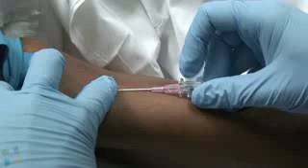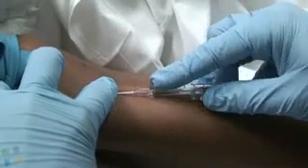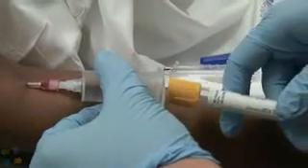While holding the needle still, slide the catheter over the needle and into the vein. Remove the needle and occlude the tip of the catheter to prevent extravasation of blood. Remove your tourniquet. If needed, attach the blood transfer device and draw blood by placing the vacuum tubes onto the covered needle.